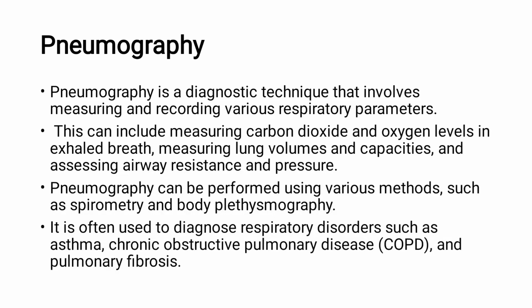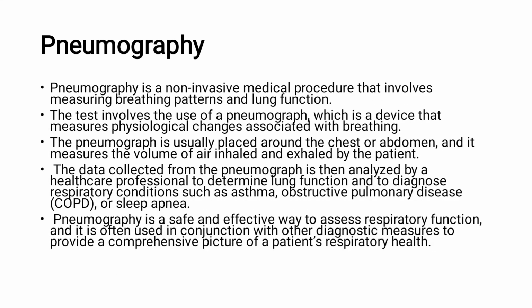This is mainly used for diagnosing respiratory disorders, mainly COPD. COPD means chronic obstructive pulmonary disease. Then asthma, then pulmonary fibrosis. This is mainly used for measuring breathing patterns and lung function. It also measures the physiological changes associated with breathing.